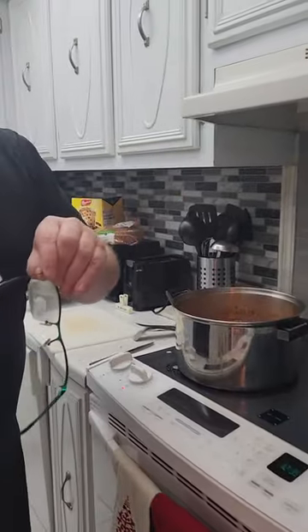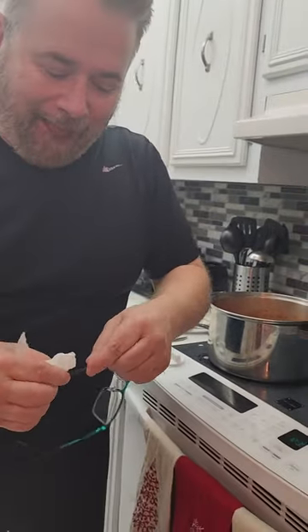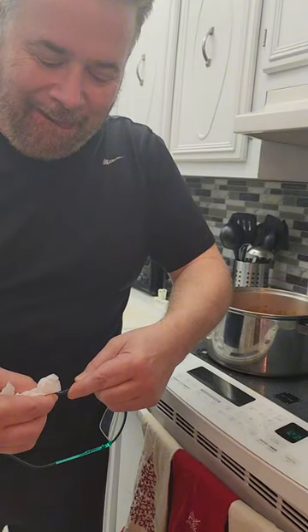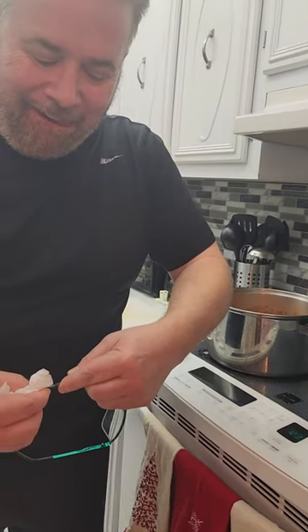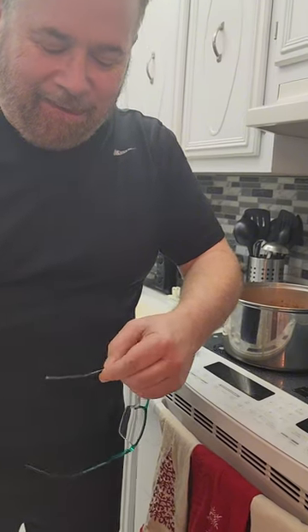I'm going to use a paper towel because it's going to be... bend it. Nice. Now they fit really good.